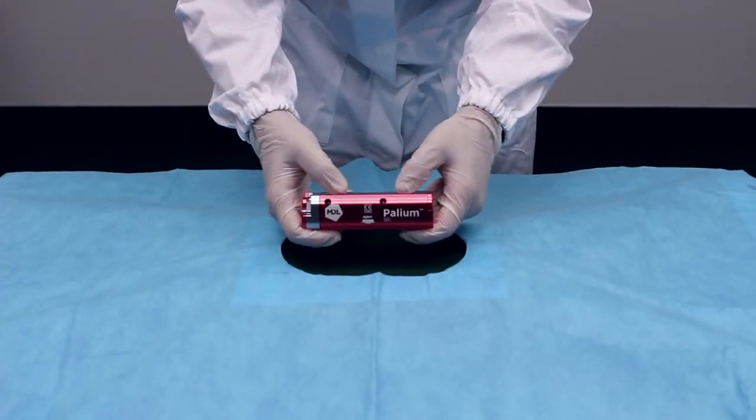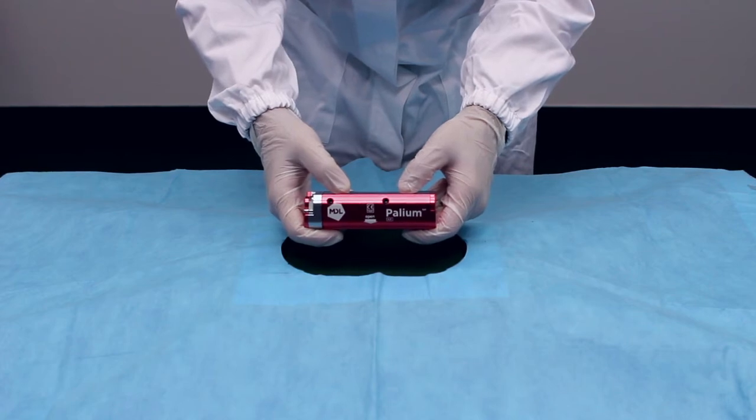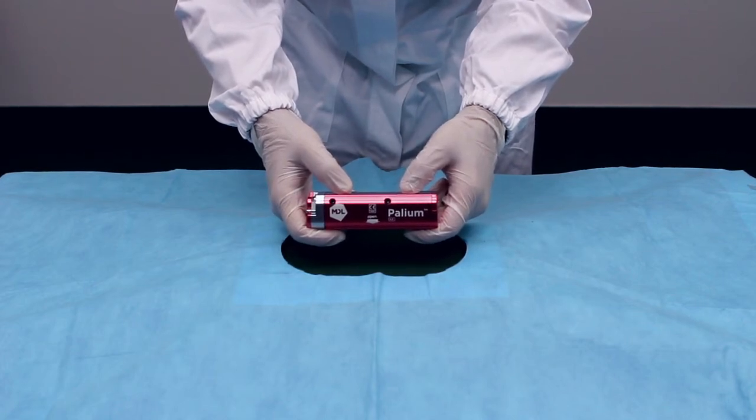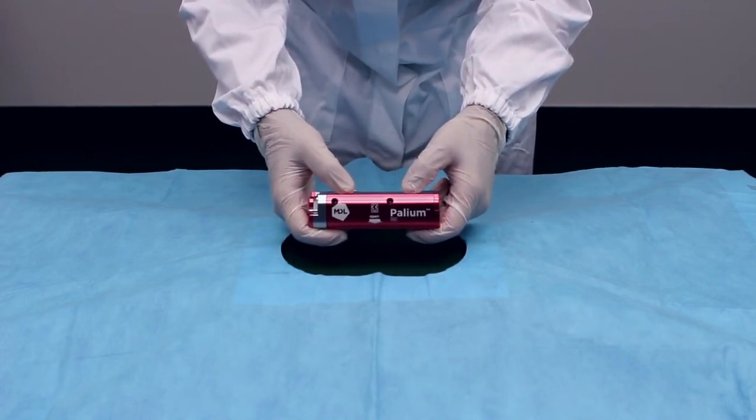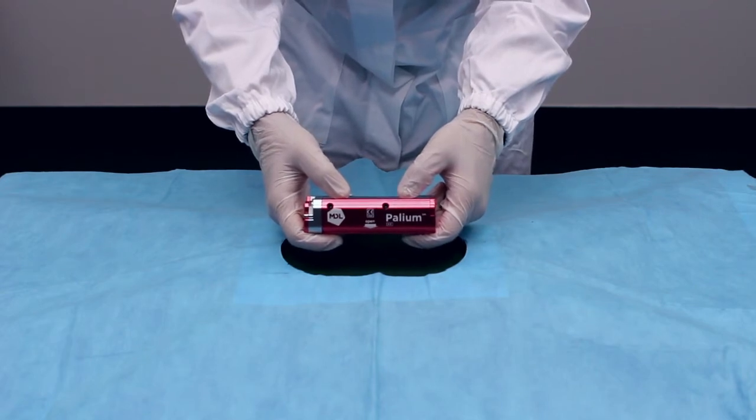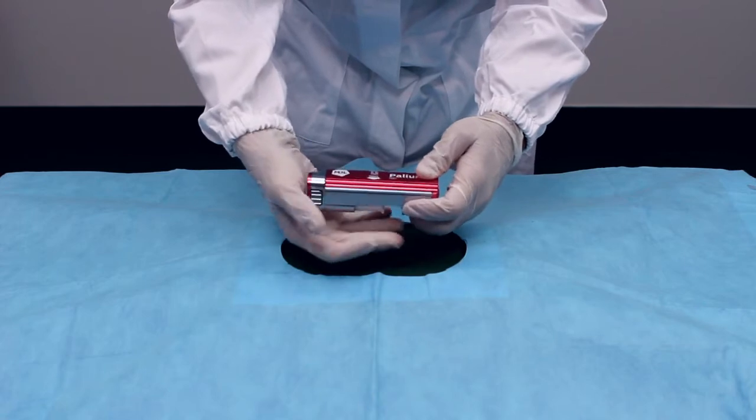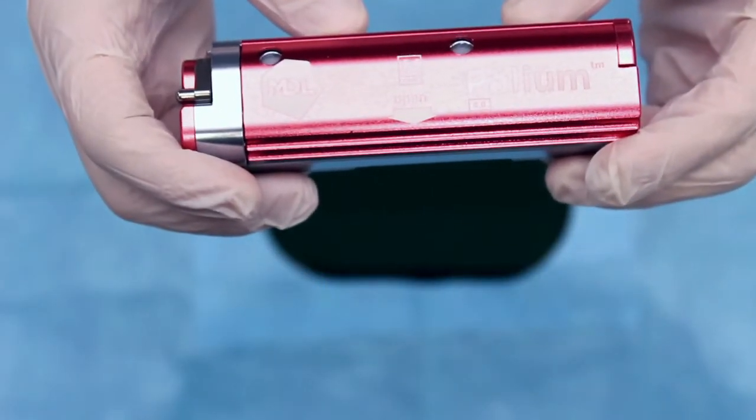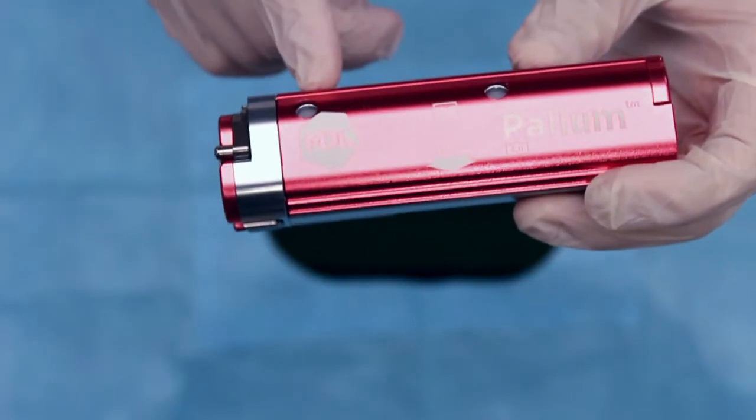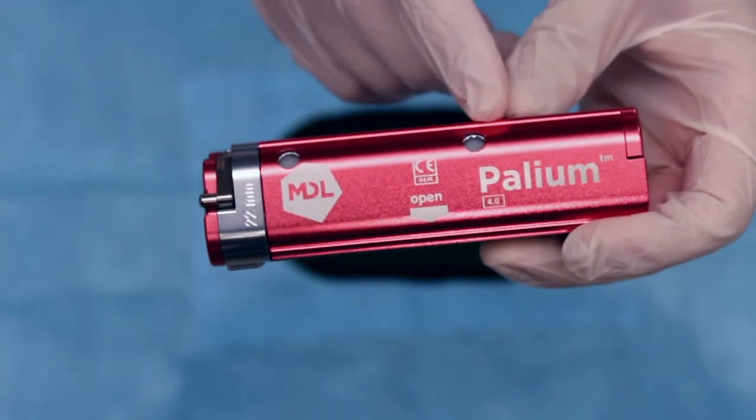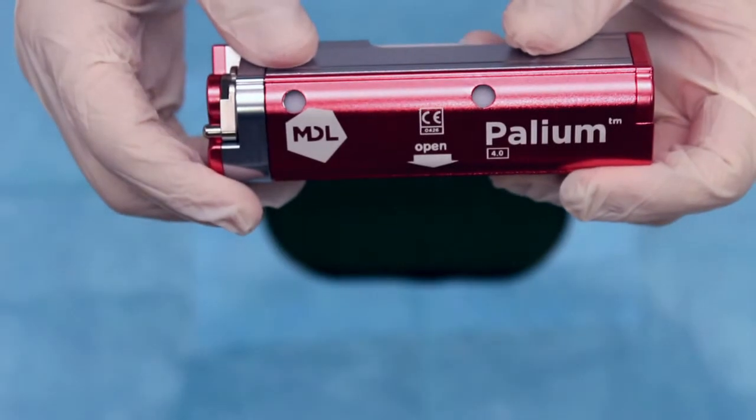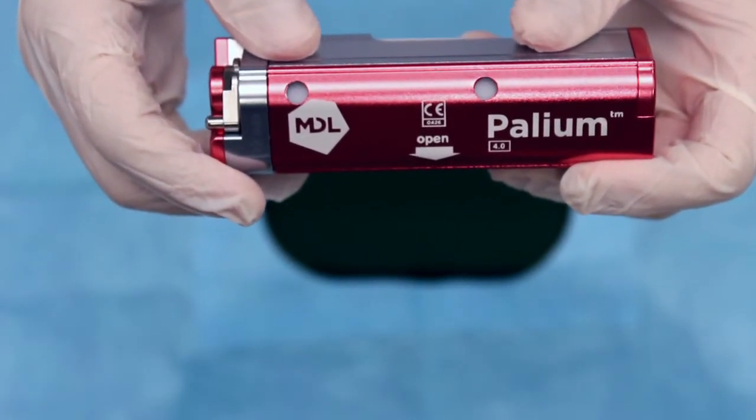To correctly use the device and ensure a safe and successful biopsy, please make sure to follow these instructions. Arm the loading handle twice to prepare the device for insertion. You can ensure that the device is fully loaded by looking at the two holes on the lid. If they are both white, the Palium gun is loaded with the safety automatically on.